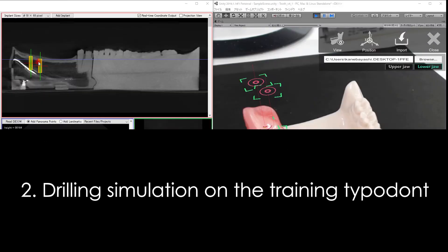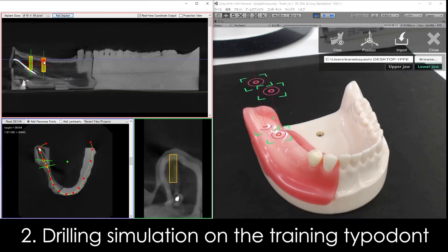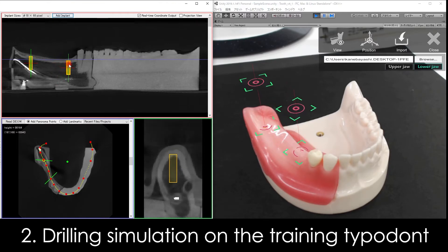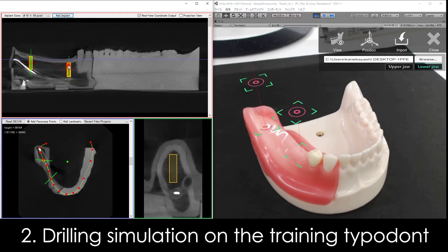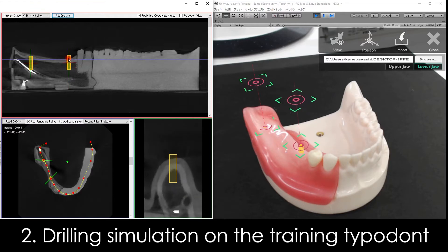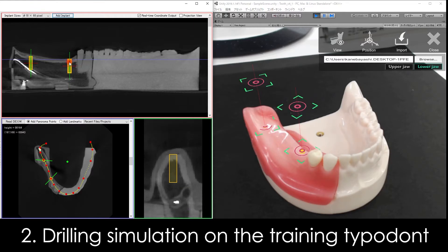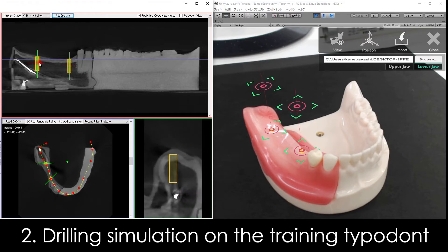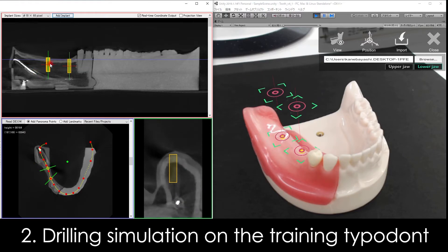Drilling simulation on the training typodont. The upper and lower rings are drilling guide rings separated from each other at the distance of the drill length. First, determine the position of the implants by moving the 3D objects to find and determine the implant placement positions.